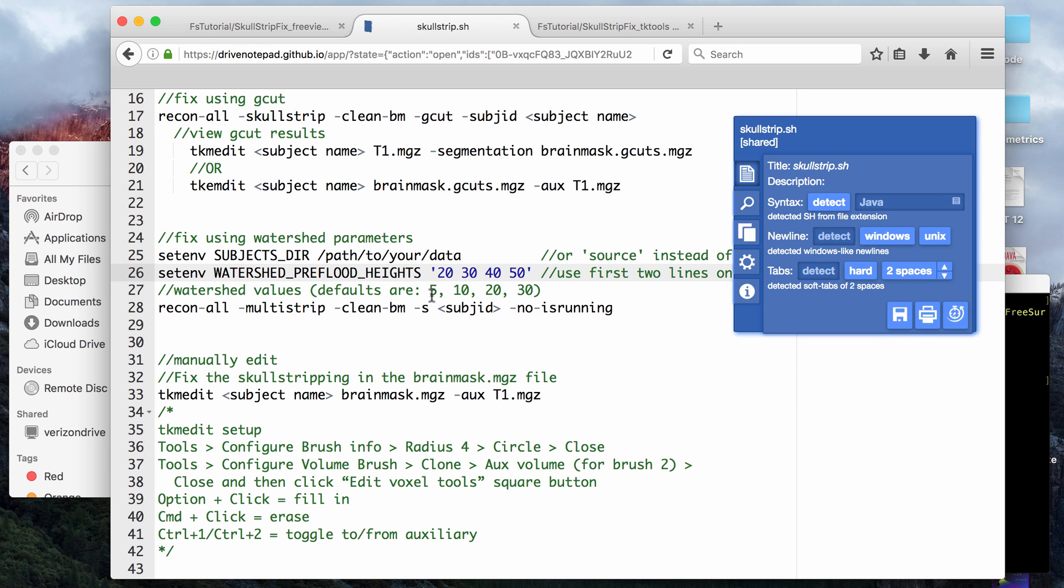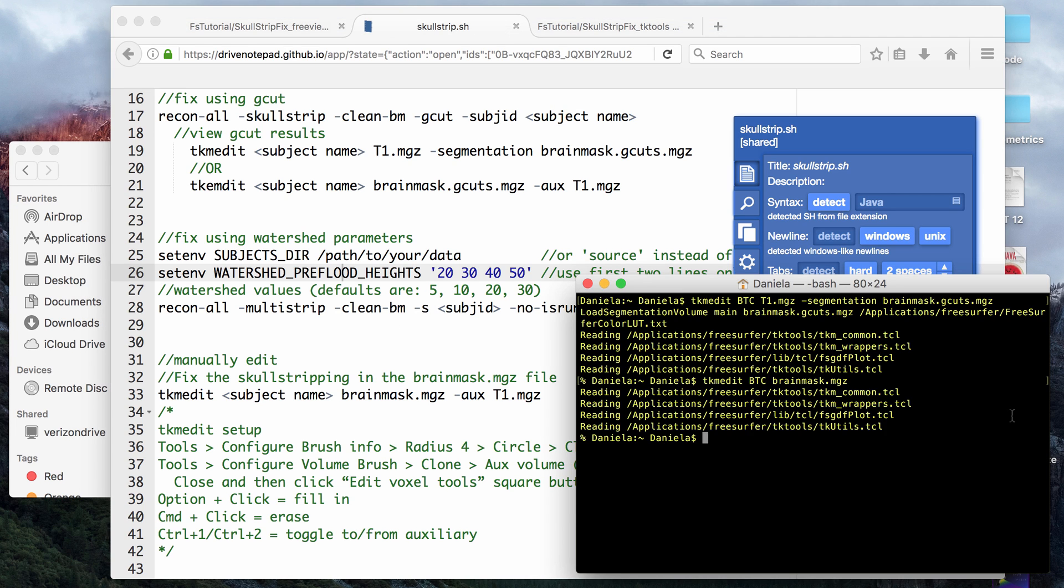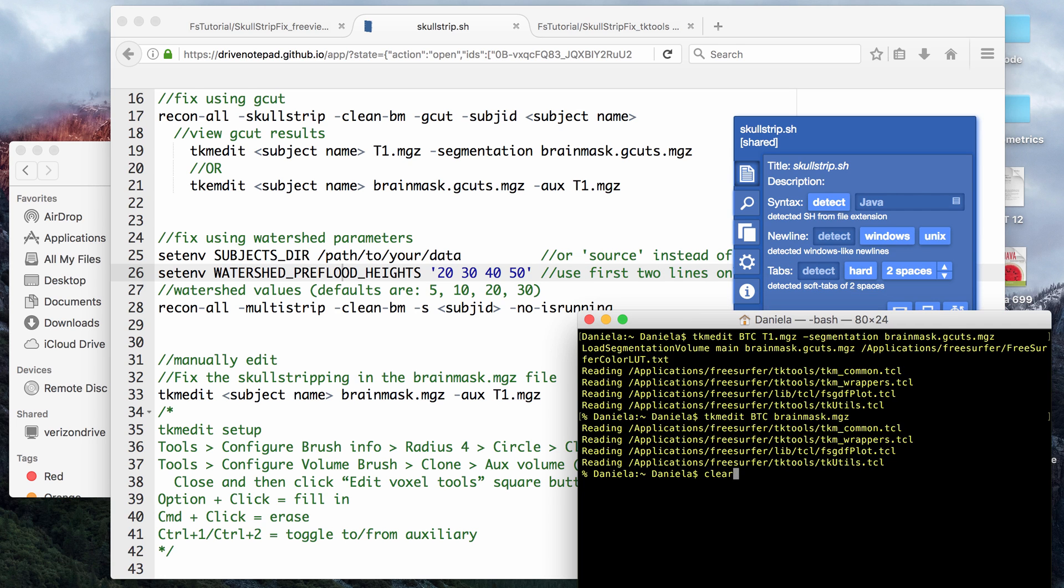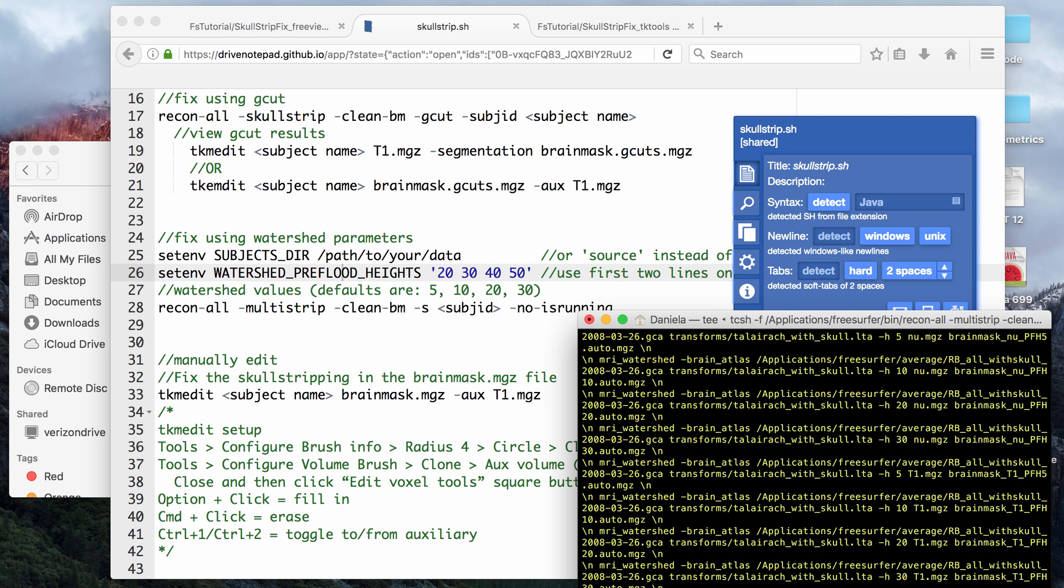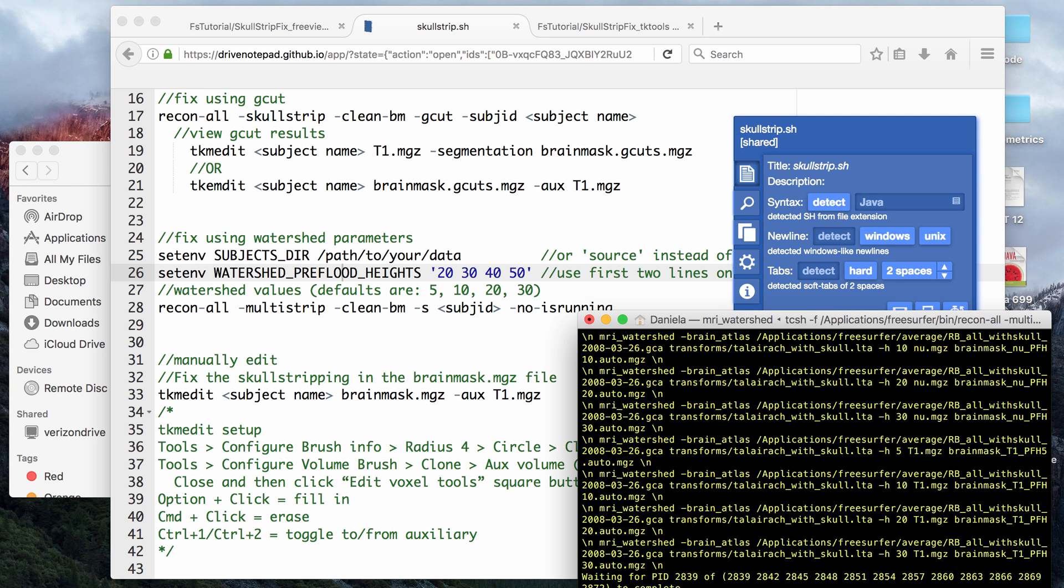I'm just going to show you what the multi-strip tag will do, and it will produce the default values, so I'm not going to bother to change the values of the parameter. If you do that, it will be recon-all, -multistrip, -clean-bm, the name of the subject, and now it's running. That will just take a couple minutes to run as well. This one takes a little bit longer than the gcuts command because it's actually doing these four different values on three different files.